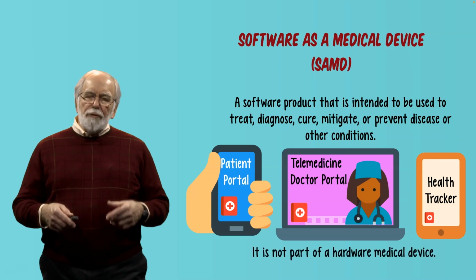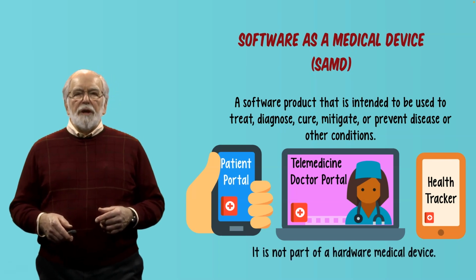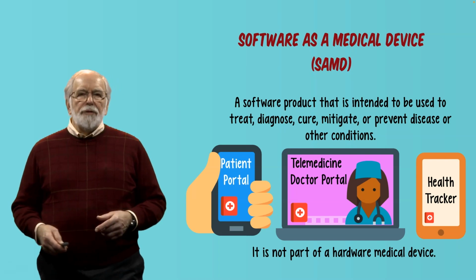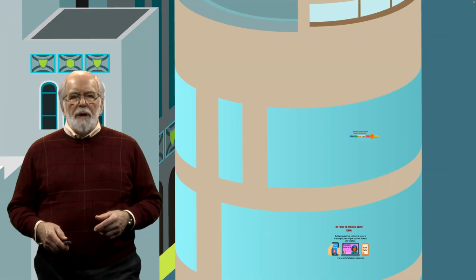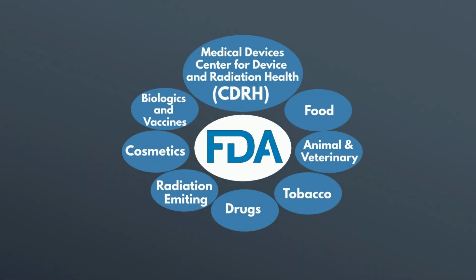It's not the software that goes into hardware medical devices. That software is regulated with the hardware medical device. CDRH is the agency within the FDA that regulates these products, as with all medical device products.